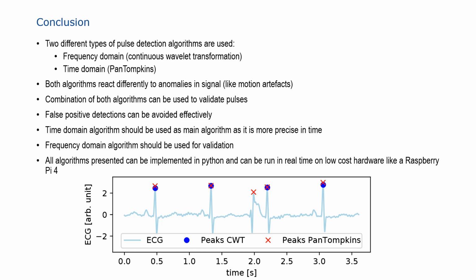All algorithms presented were implemented in Python and can be run in real time on low to mid-range hardware, like a notebook or Raspberry Pi 4.